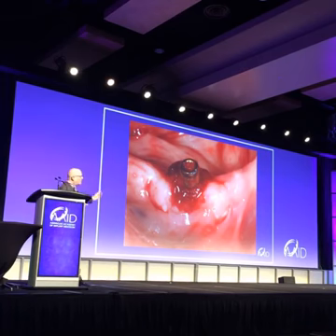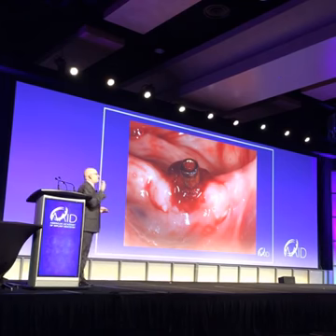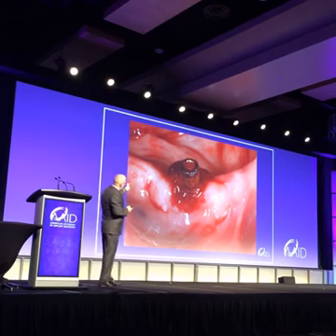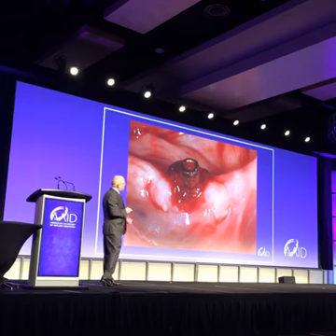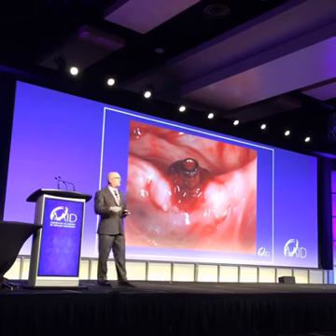Here's the blood clot around there, and everyone goes, oh my God, you touched the implant. Who cares? Why are we all concerned about touching the implant? I mean, I touched the abutment there with my piezo. Oh my God, I scratched it. Oh my God, I touched the implant with my piezo.